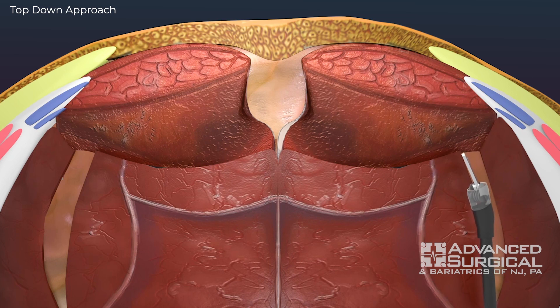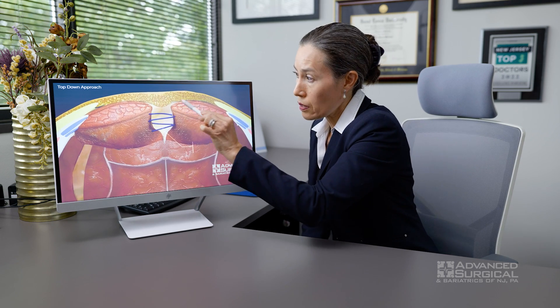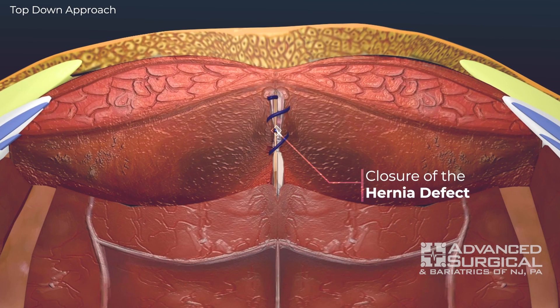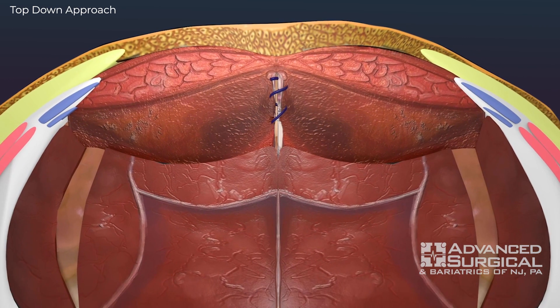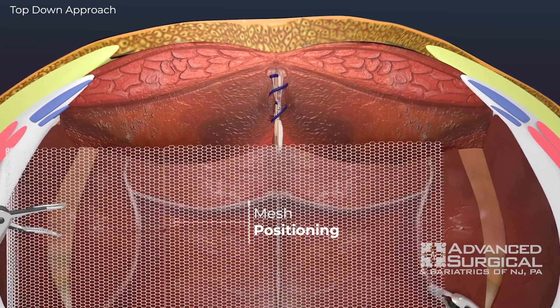Sometimes we decide on the muscle release during the surgery, depending on the dynamics of your abdominal wall and how everything is going to come together. It allows for better overlap of the material and less tension on the closure. One of the things that works against hernia repair and leads to recurrence is having tension on the edges of the hernia as it's sewn together, so we want to reduce that as much as possible.